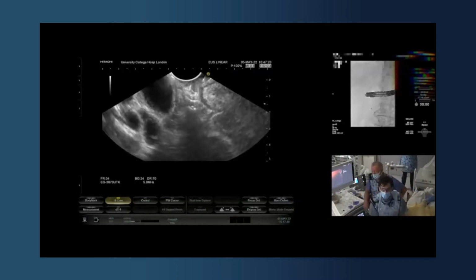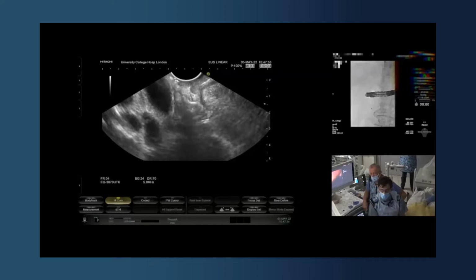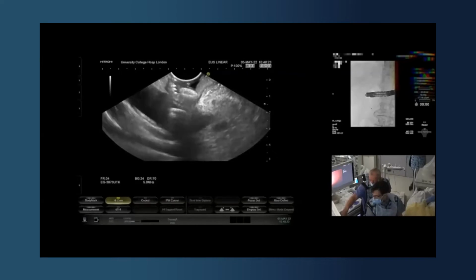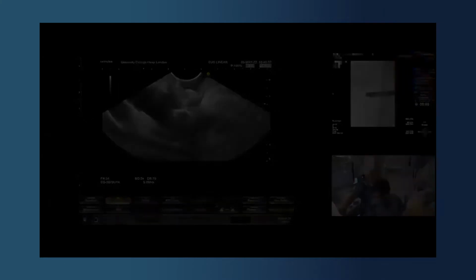And that's taken a total of about 1 or 2 minutes to get biliary drainage in this patient who's had previous 2 procedures. Good. See the flange in the bile duct? It's already decompressing, I think, and you see the duodenal flange very nicely in the duodenal lumen. Okay, so lovely, lovely case.